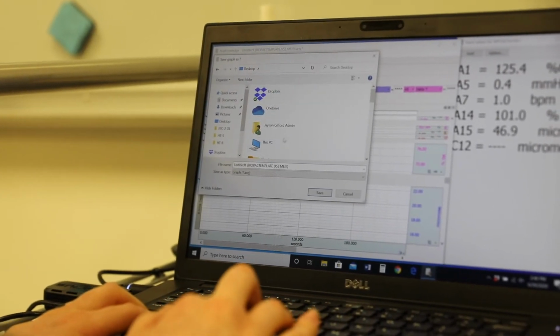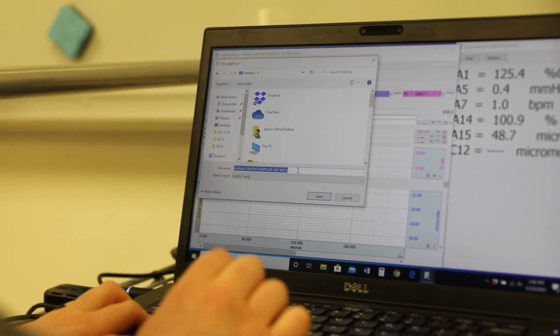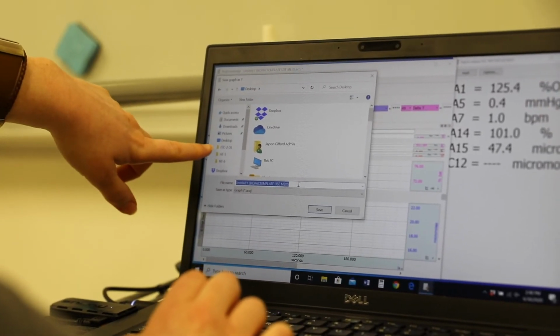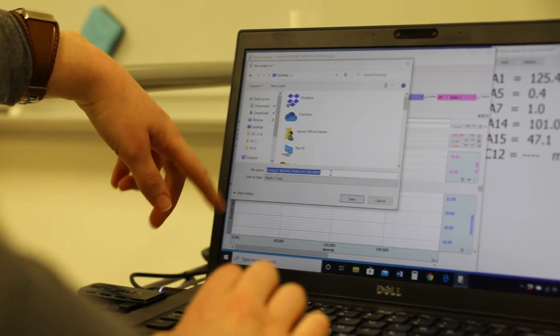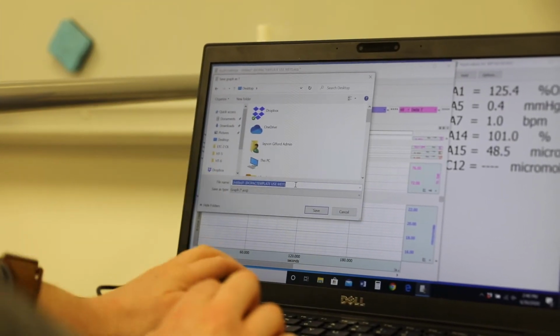I'm just going to save this to the desktop for now, but you'll want to save it in the Studies file under the Subjects file. So you can see over here some of the subjects in the past were HT5 and 6 and ETC2. You'll want to save this file in the specific Subjects file.